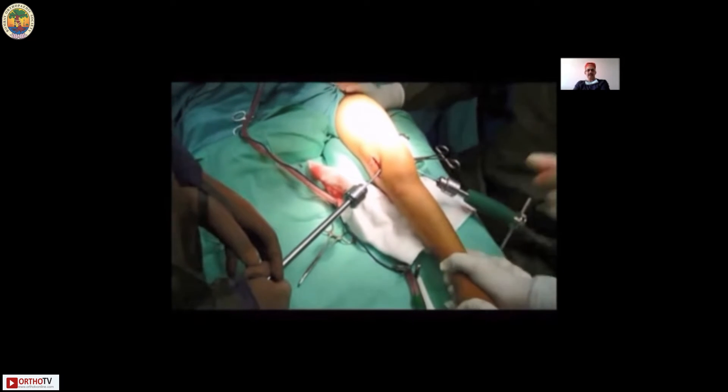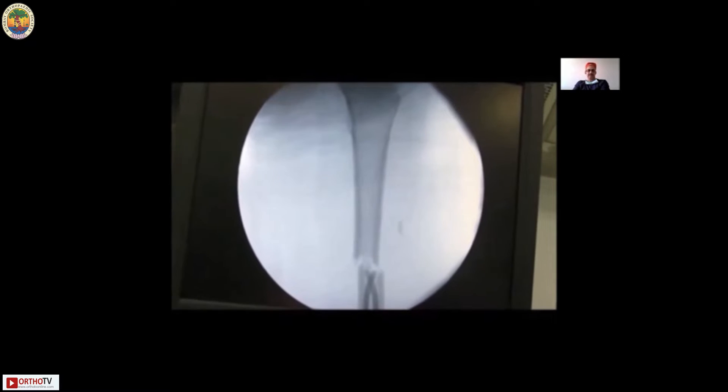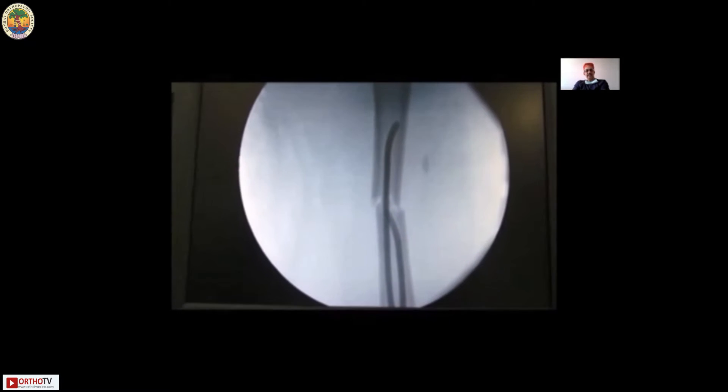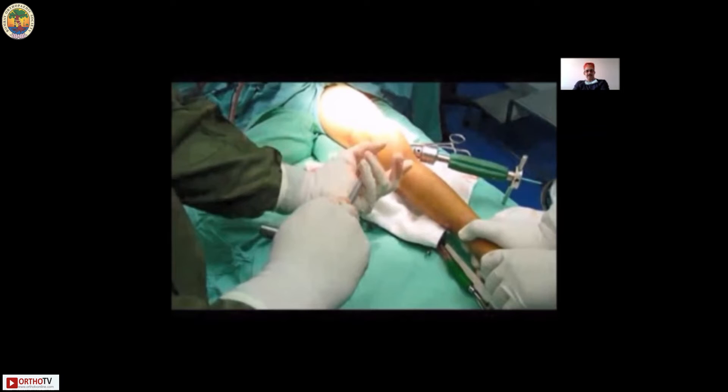Make sure that the canals are now lined up perfectly. Here, using the lateral nail, I have passed the nail into the proximal fragment. It's engaging on the tip of the proximal fragment, so you turn it a little bit — and there you have engaged the proximal fragment. Pass the nail about a centimeter or two, and then you'll realize that because of your nail bending, the femur gets deformed into valgus. Now we need to pass the medial nail with gentle small rotational movements to advance gradually.